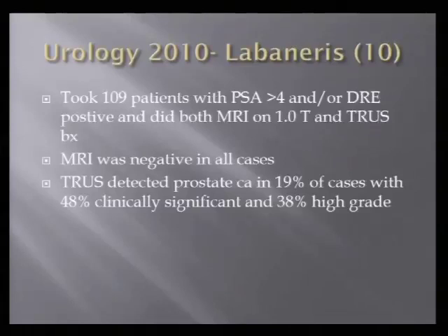The gist of this is that while MRI can find cancer, there are a lot of cases of cancer that are caught on a biopsy that MRI just totally doesn't see. And I see that all the time. During that month I was doing this, and even here, there's a lot of times I'll look at your biopsy reports and I'll go, wow, it was positive there on the left, and I'm looking at the MRI and it's not there. So that should not be the purpose of this.